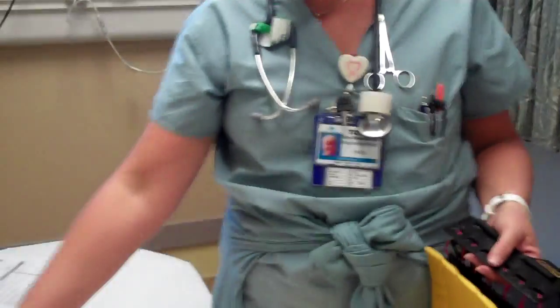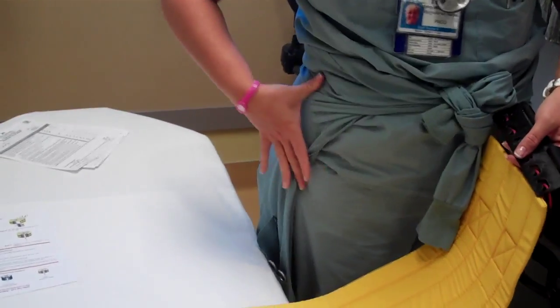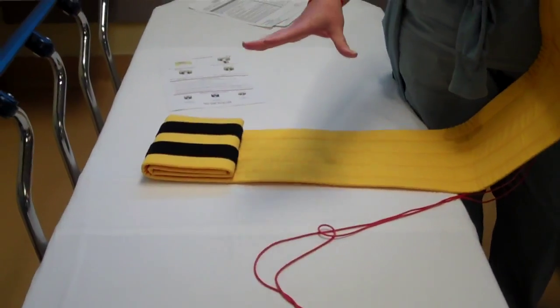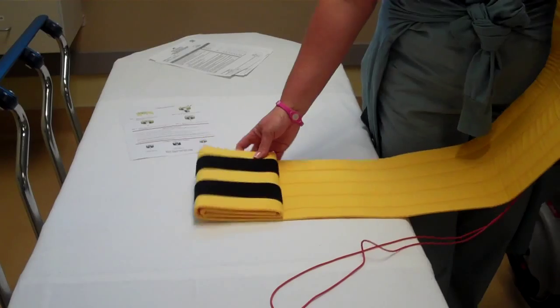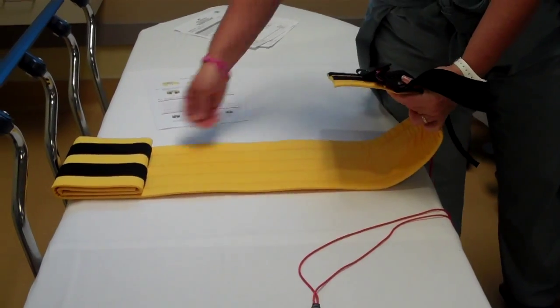So what you're going to do is unroll it. The symphysis pubis is right across here — you want it in this area, to be able to compress the area. Once you unroll it and your patient is on the bed, if they are in C-spine, you'd like to maintain C-spine precautions, so make sure that you have help rolling. You're going to roll it onto your patient under the direct area of the symphysis pubis.